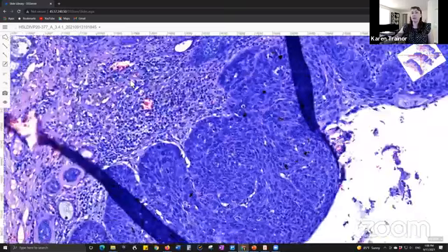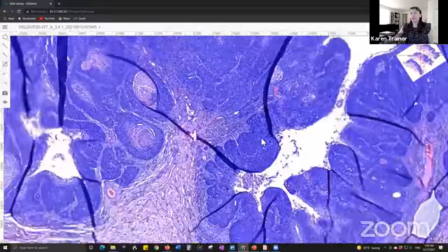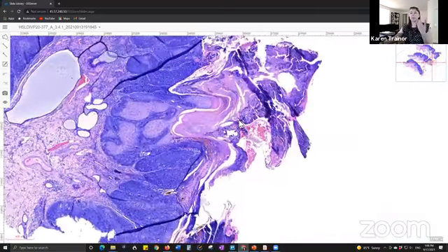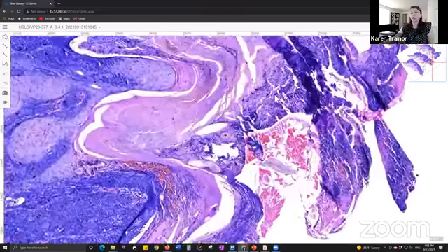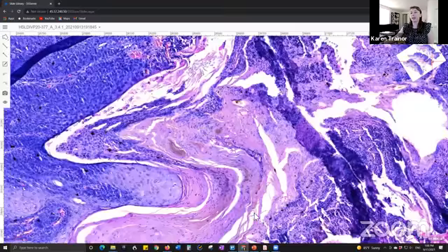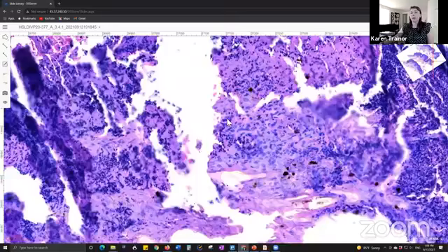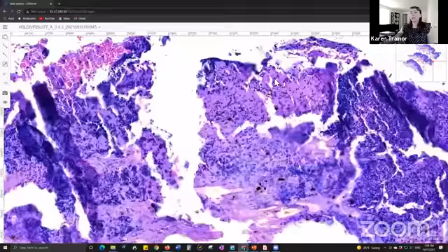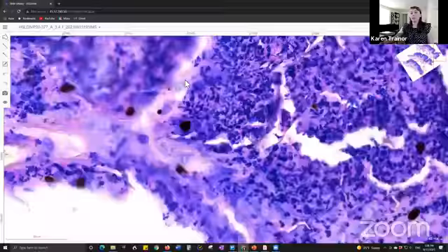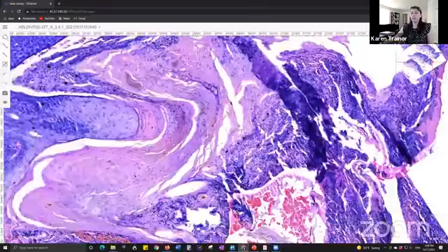We can just see the swirling pattern. There's lots of different changes to see, and there can be secondary infection with these. Oftentimes, remember, we saw perhaps some crusting in those clinical photos. Here we have a large accumulation of serocellular crust and a mix of orthokeratotic, parakeratotic hyperkeratosis. We can see these accumulations of melanin pigment as well. It's not uncommon for these to have some degree of bacterial infection. I've also seen these present with malassezia as well. So any number of permutations and presentations with this condition.